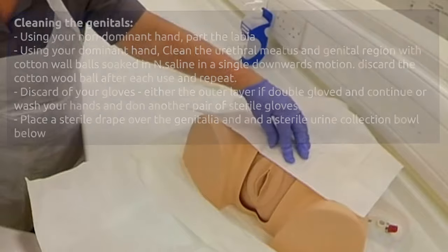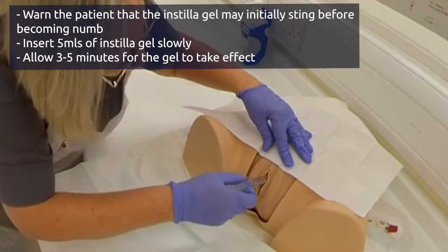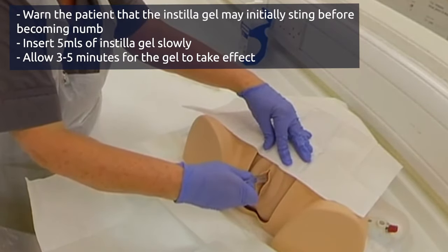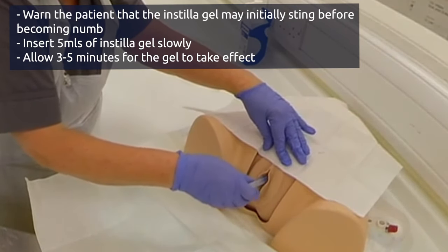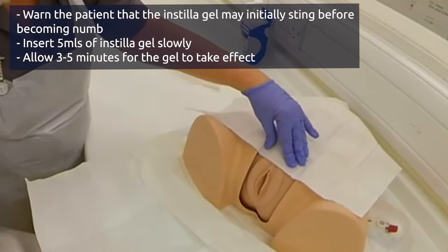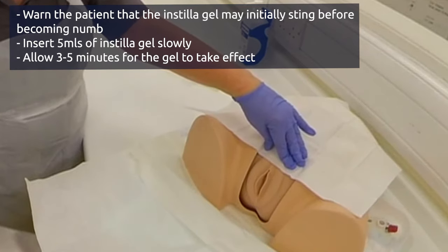That's really good, thank you. I'm just going to pop some instillagel into your urethra as you open into your bladder. It might be a little bit uncomfortable. I'm just going to insert that. I just need to leave that for three minutes to let that work, so that's got a local anaesthetic in it.